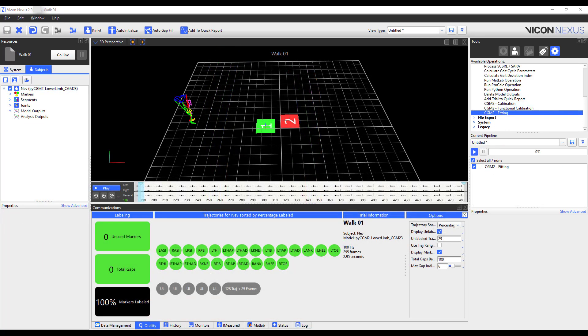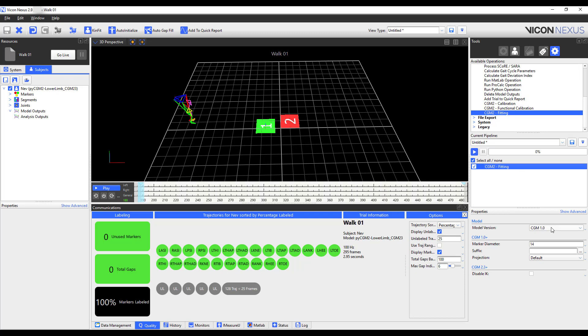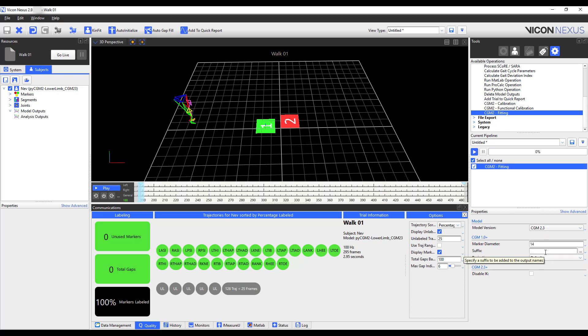In the dynamic trial, I've already reconstructed, labeled, cropped, and gap filled to eliminate all gaps as shown here in the data quality tab. I've already selected CGM2 fitting, and will specify the model below. So that would be CGM2.3. Similar to the calibration trial, I will add in a suffix, underscore py, and then I will go ahead and run the model.